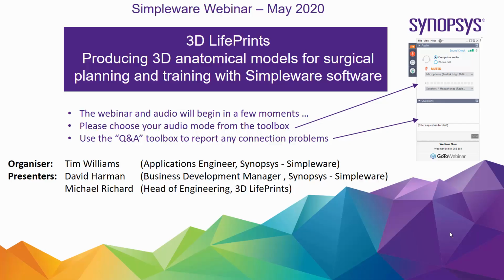I'm very pleased to say we have a customer webinar where one of our customers will be providing a bit of detail and a presentation on what they do and how they use Simpleware software. The customer is 3D LifePrints, and they're going to be presenting on how they produce 3D anatomical models for surgical planning and training with Simpleware software.